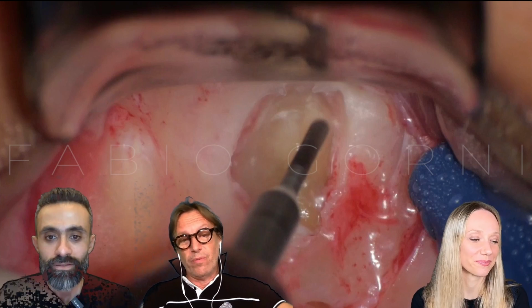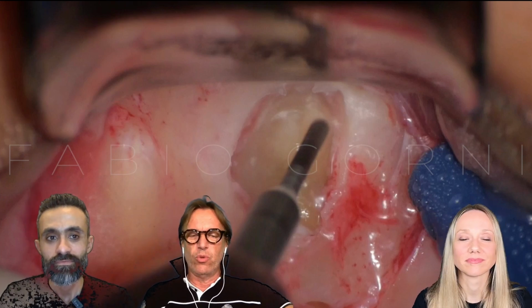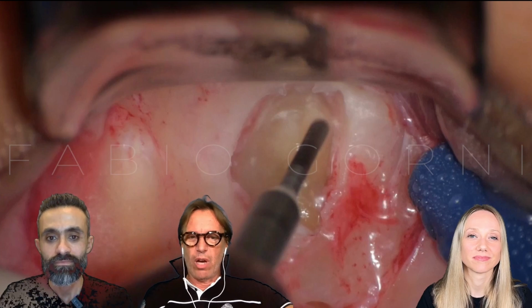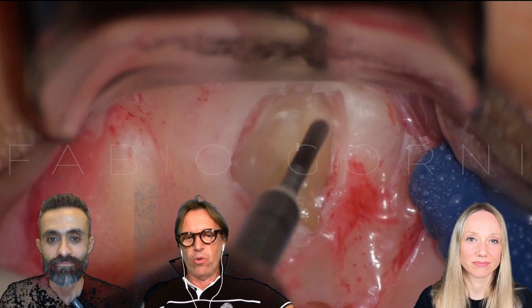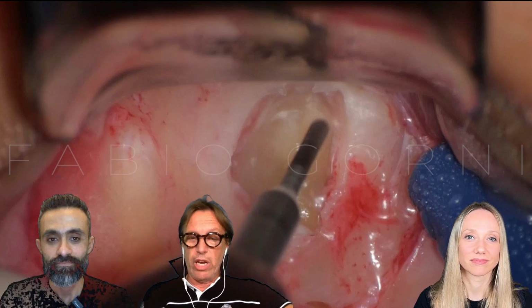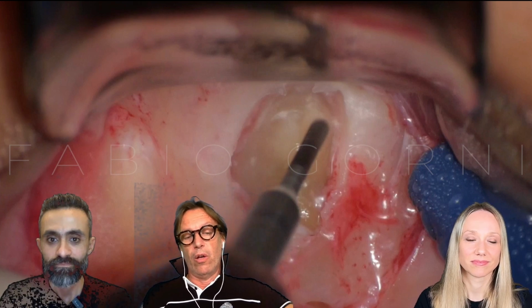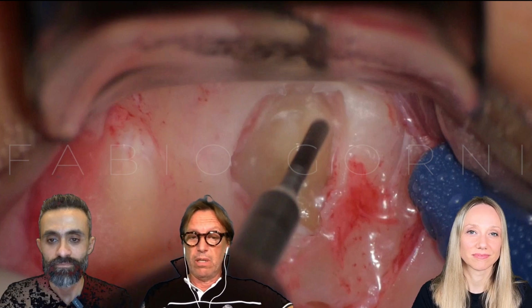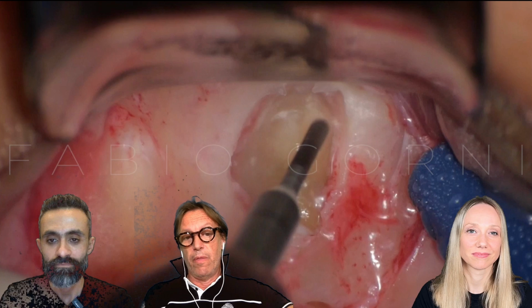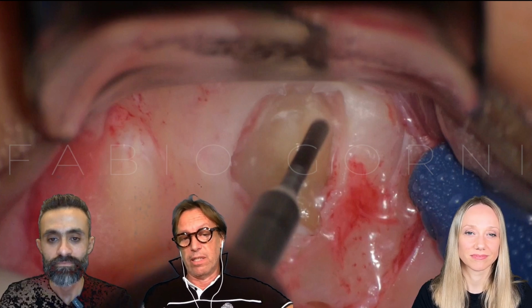Because the apical resection is a dynamic action. So we have to decide how to cut the root only in function of the anatomy and the position of the lesion. So many times we have to change the angulation of the resection step by step, just discovering the anatomy, just discovering the problems that we can have inside of the root canal system.